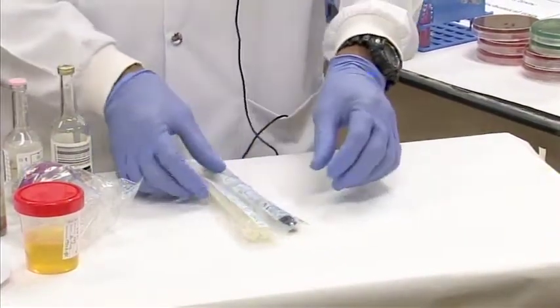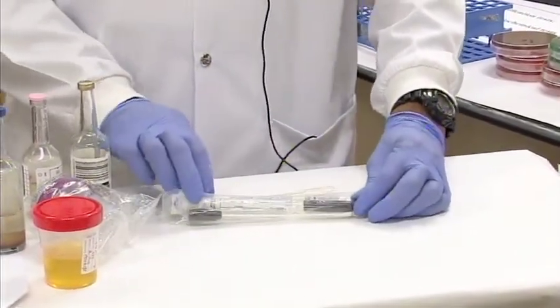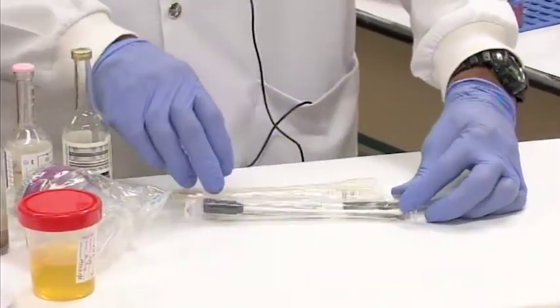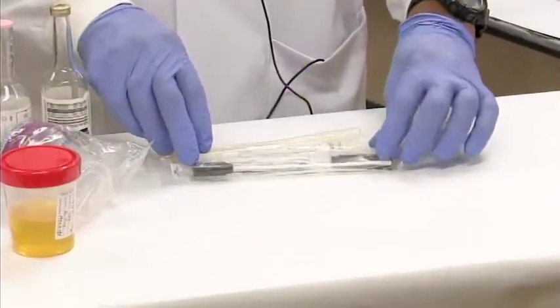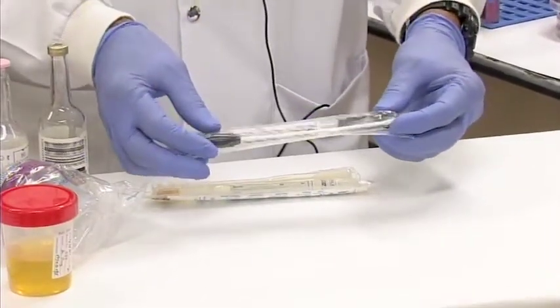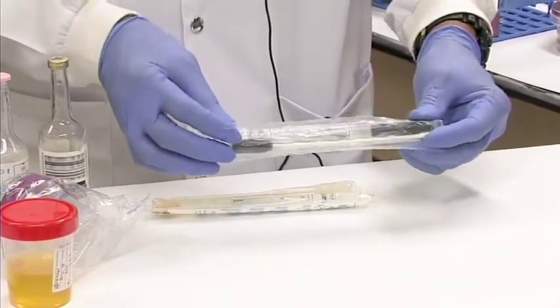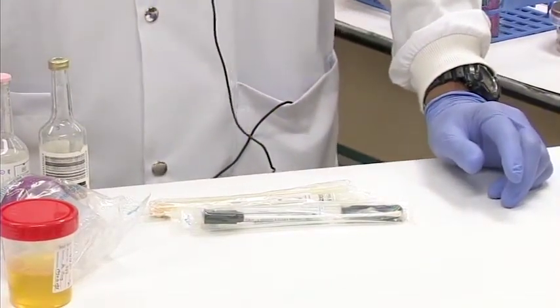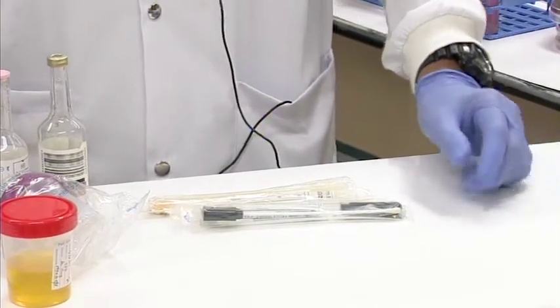Also, you can have culture swabs. These swabs are used to collect specimens, for example, throat swab, sample from the skin, nose, any wound swab, and so on. They are made with a large cotton-tipped applicator and a transport medium where you place the swab after collecting the sample and send it off to the lab. Ideally, samples will be transported within 1 to 2 hours to the microbiology lab for proper yield of the etiologic agent.